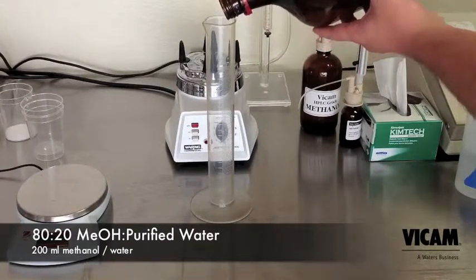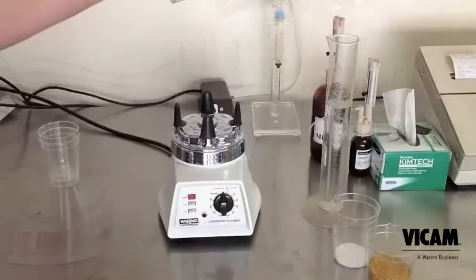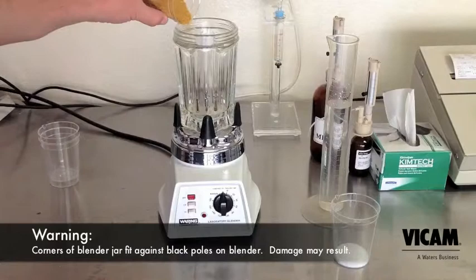This mix is available in a premix from Vicam, or you can make your own. Add the sample, salt, and methanol to the blender jar. Set the timer just past 60 seconds and blend on high.